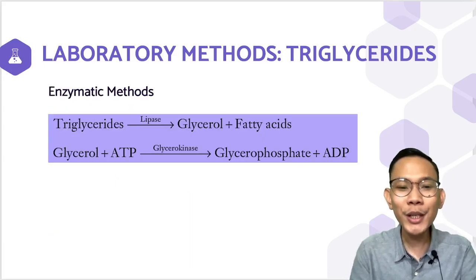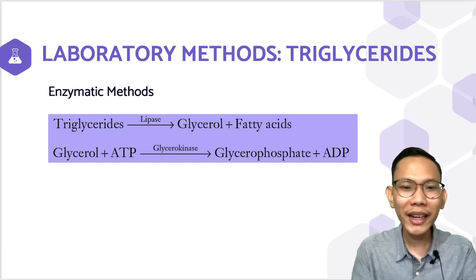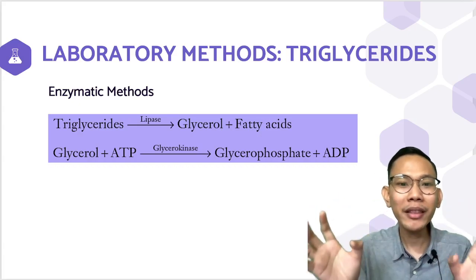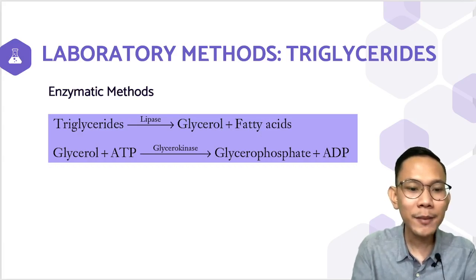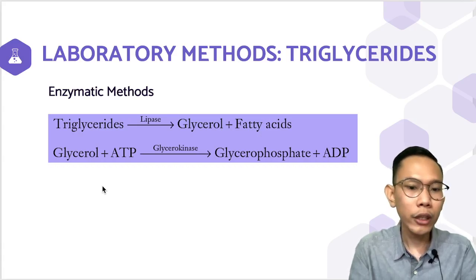Again, of course, we have an enzymatic method for your triglycerides. So, yung enzymatic methods ng triglyceride, masyadong marami. Pwedeng ganitong pathway ang dadaanan niya or pwedeng ganitong pathway, pero at the end point niya, kaya niyang i-detect ang level ng ating triglycerides. So first, again, there are several different enzyme reactions that can be used in all methods.